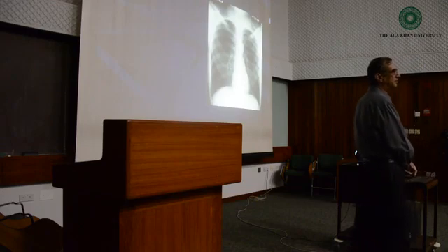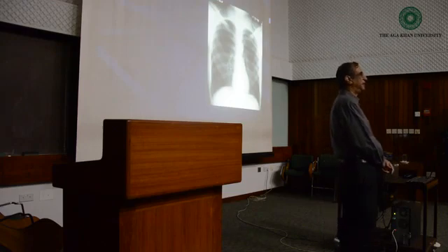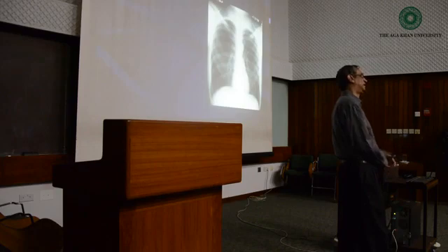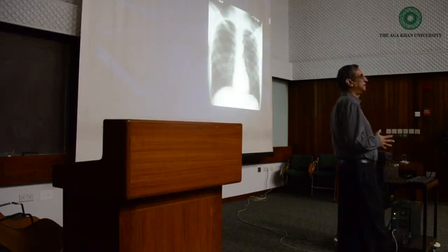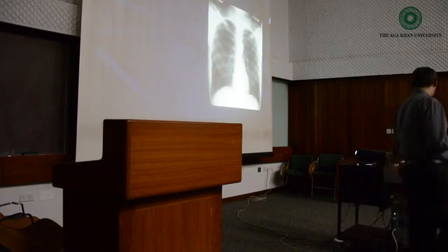So if you ever visit fluoroscopy, or if you are attending to a patient and the X-ray team comes to perform an X-ray, if you are supposed to stand there, you are given a lead apron. That lead apron cuts off the radiation most effectively. So that is for your own protection.